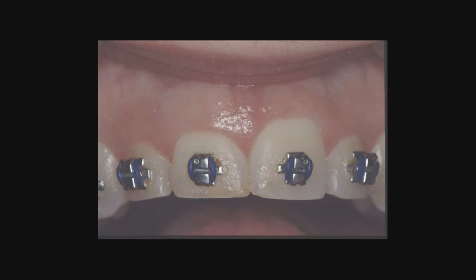Now, this is an interesting case. We notice the gingival asymmetry between number 8 and number 9, and this patient was a rugby player, and he fractured off the incisal edge of this tooth, and the orthodontist elected to smooth that edge up and then extrude the tooth to match up the incisal edge. In retrospect, this was a mistake because the tooth should have been restored. But in any event, now that the tooth has been extruded, what do we know? First of all, it was slowly extruded, which means that the bone on the facial of that is very thin. So therefore, we're going to do a modified technique on this.